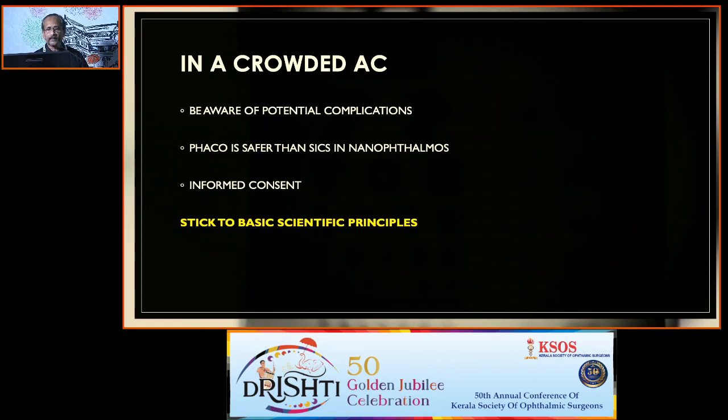So in crowded eyes, beware of potential complications. Phaco is far safer than SICS in a nanophthalmic eye. Always get an informed consent, and always stick to basic scientific principles. And with that, I think I'll stop. Thank you so much.